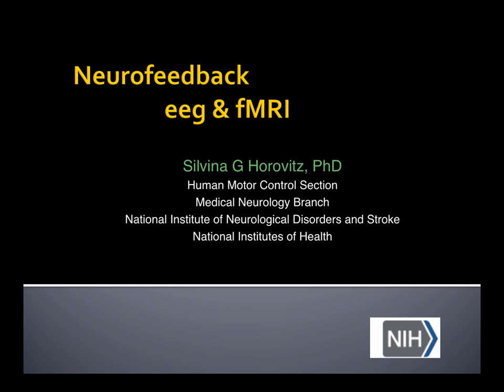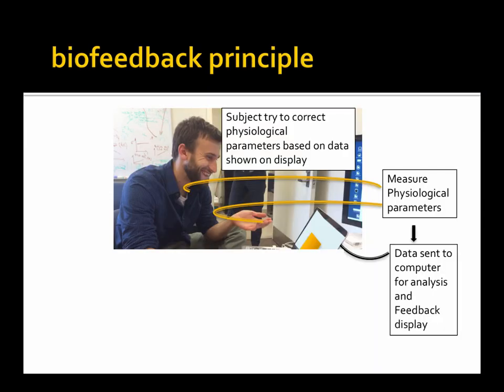And second, most of the things that I will show will not necessarily have EEG and fMRI simultaneously. Actually, most of it would not, though we are going to discuss a little bit on how to combine them. But mainly we are going to focus on neurofeedback. So probably all of you are familiar with what feedback is and what the biofeedback principle is.